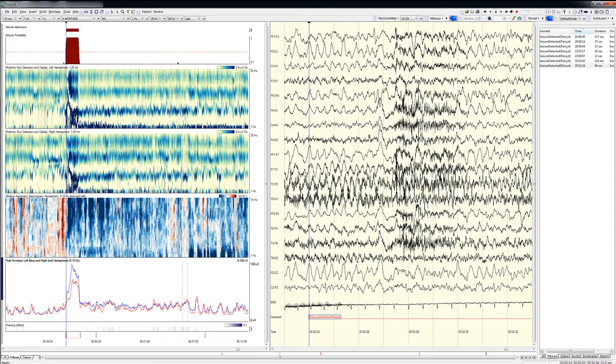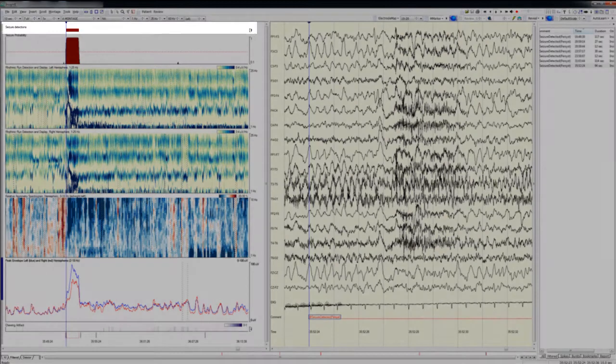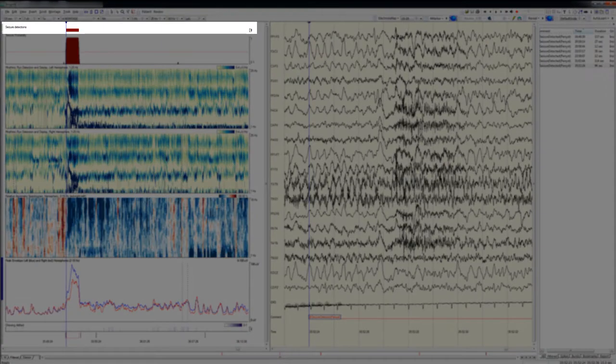This particular 30-minute trend example demonstrates a graphically prominent seizure that comes to involve both hemispheres roughly 12 minutes into the trend window. At the top of the panel is a seizure detector graph, which simply shows a red bar if a seizure has been detected at any particular time.